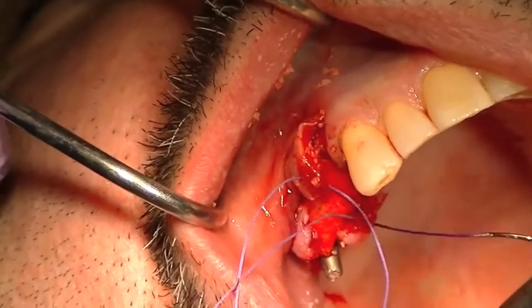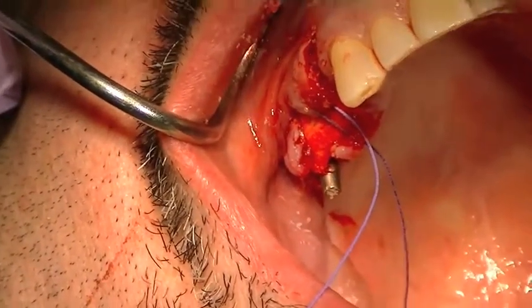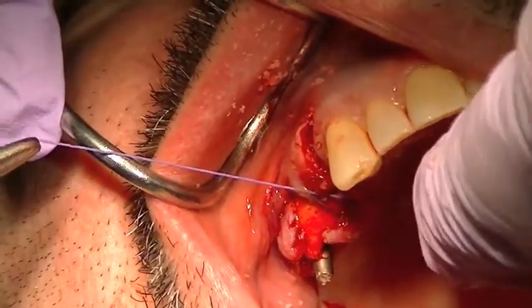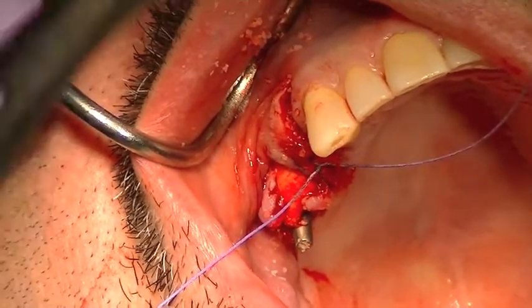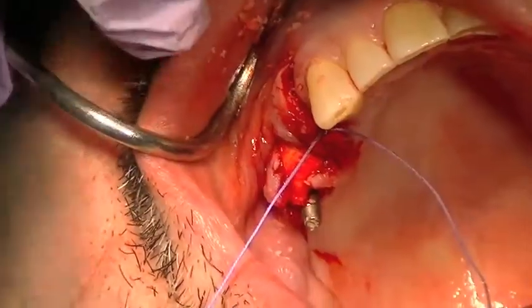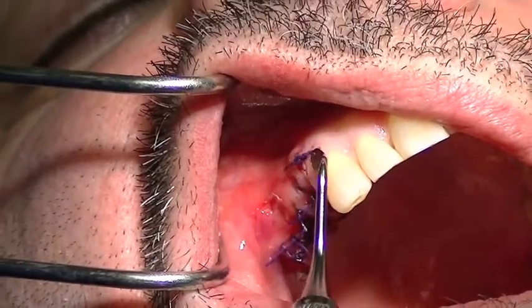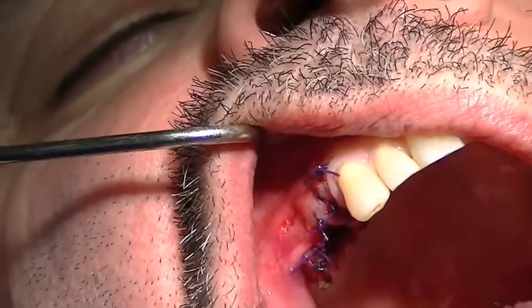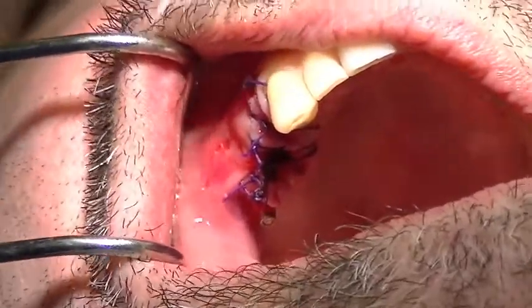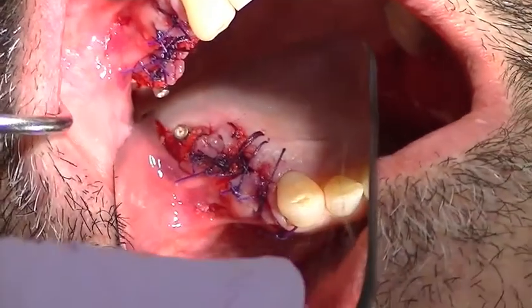Here I'm using a Vicryl type of suture. What I like to do is take my needle from the crestal to the facial, and then from the crestal to the palatal, and then I'm simply tying my knots to establish proper contours of the tissue. Just take some time, manipulate the tissue, and you can see we have attached gingiva present. If we can get a band of three to four millimeters of attached gingiva, we're going to have an excellent site for future implant placement. You can see the sutures are maintaining the area — there's nothing pulling or tugging those sutures apart.